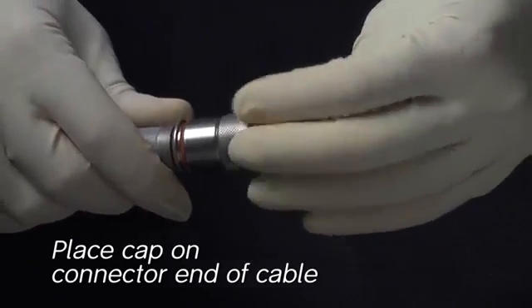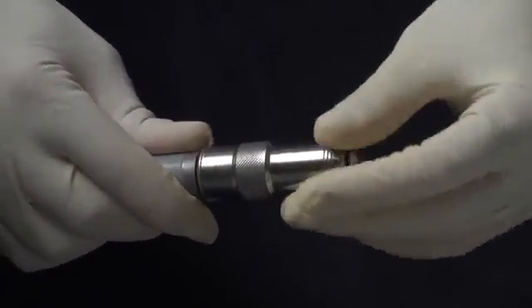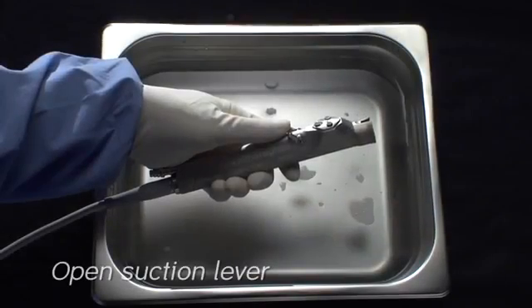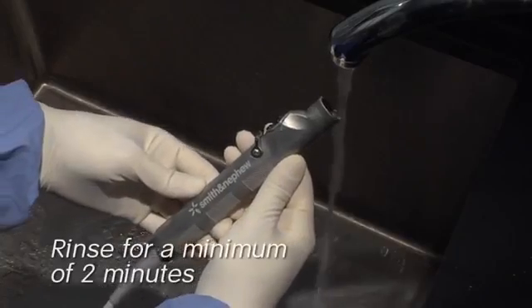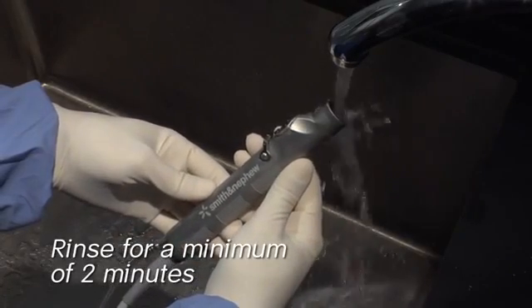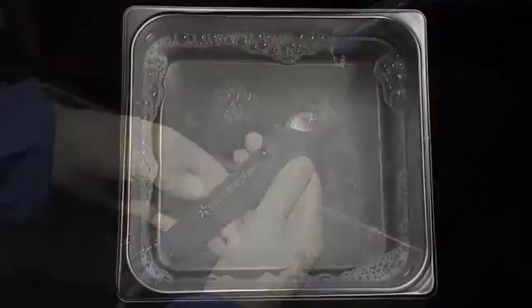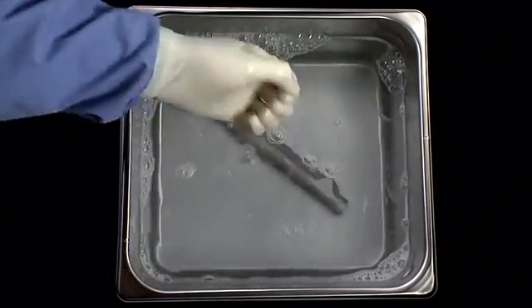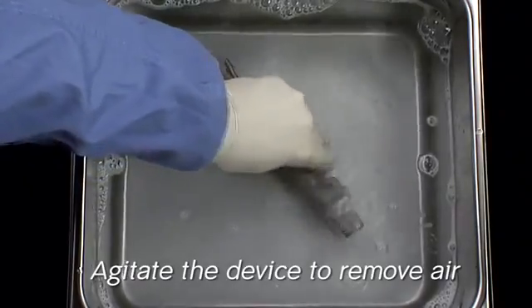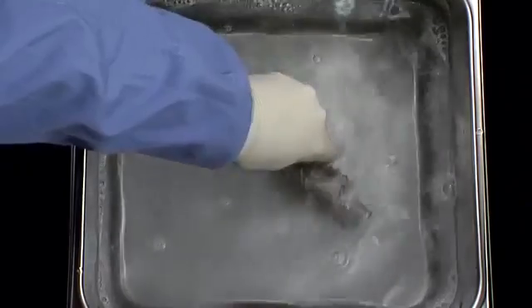The following cleaning steps are what you will need to know. Place the protective cap on the connector end of the cable. Set the suction control lever to the fully open position. Rinse thoroughly with warm tap water for a minimum of two minutes, making sure to irrigate all features of the device. Immerse the handpiece and soak for a minimum of five minutes using a neutral pH enzymatic detergent. After immersion, agitate the device to ensure all of the air is removed from the device lumen.